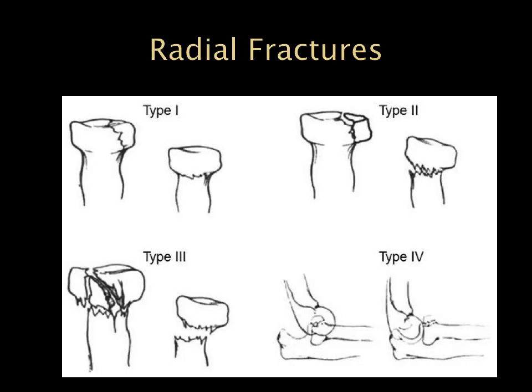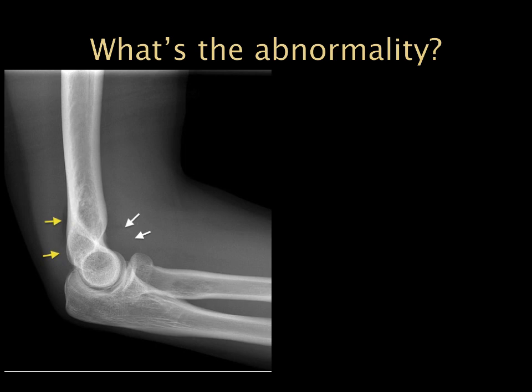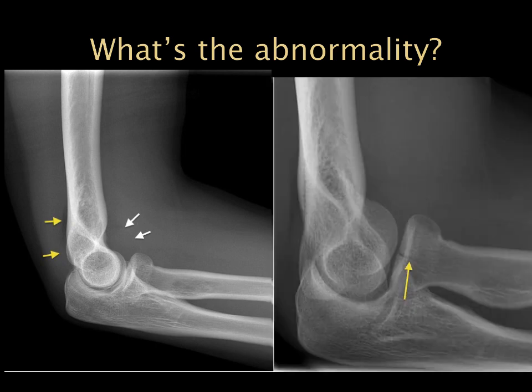We also have radial fractures of a few different types. Some are more subtle, such as this radial neck fracture where all we're seeing is slight angulation. On another elbow x-ray we see a joint effusion but no fracture is clearly visible on one view. However, with a slight change in angulation on a different view, we can see a non-displaced radial head fracture.